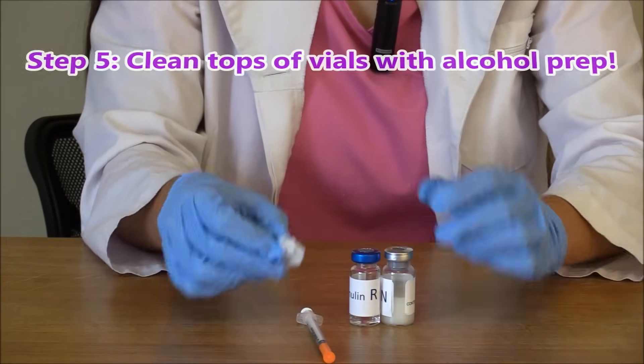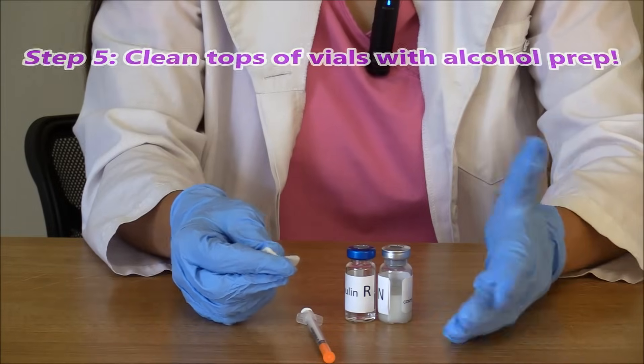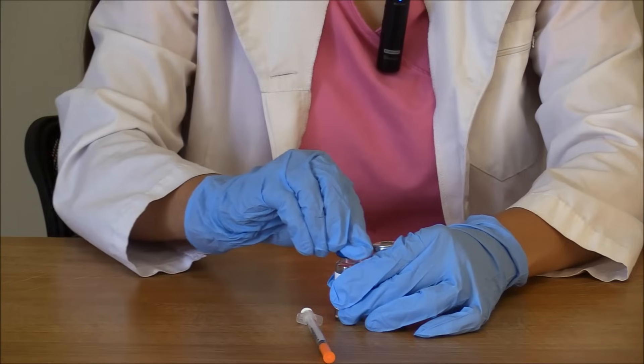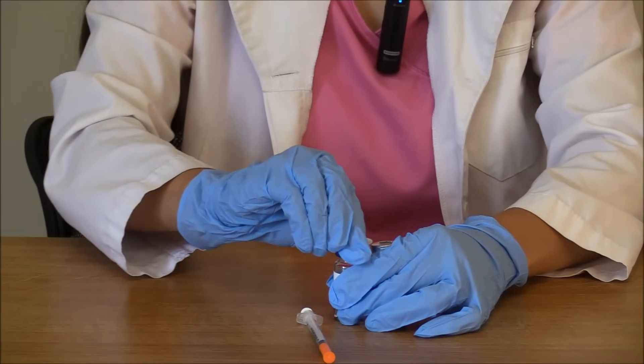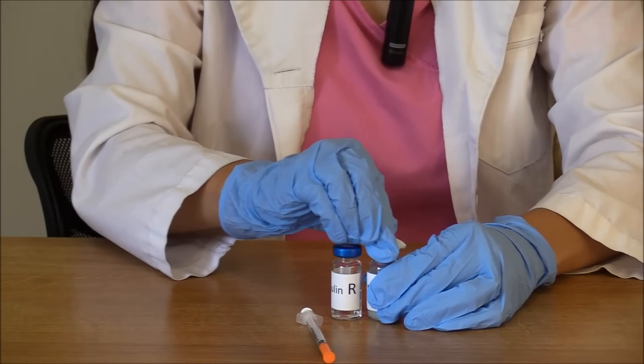Next, we're going to take our alcohol prep and clean the tops of these vials to make sure we're getting rid of germs. Just clean each vial for about five to ten seconds really well.